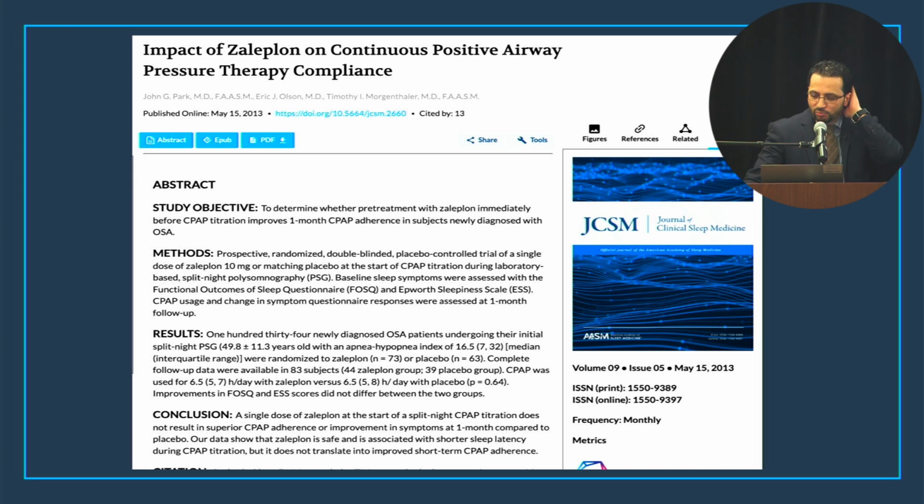In our lab, we have a hypnotic protocol for younger patients that the technician can go with. If the patient is younger, doesn't have any significant comorbidity, and is not already on hypnotics or benzos.